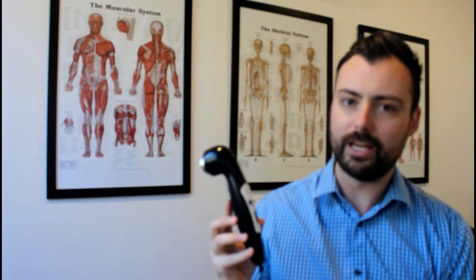So the machine is an ultrasound. The way we use this machine is we apply the ultrasound gel to the head of the unit as well as to the affected body part.